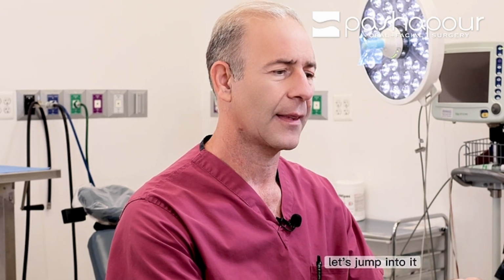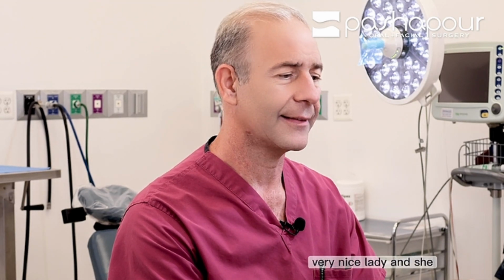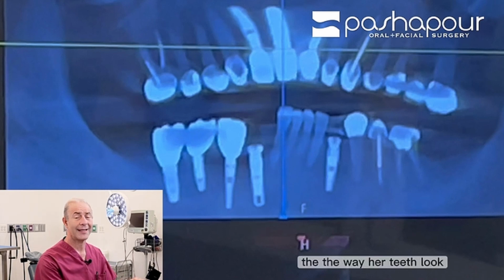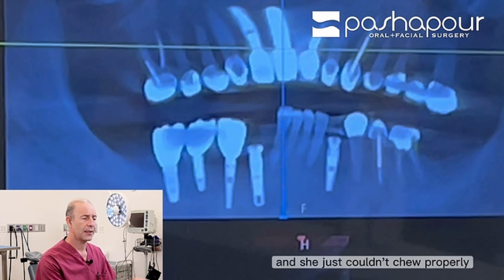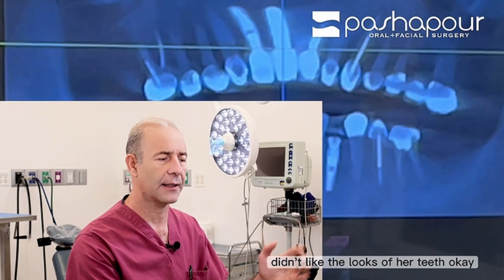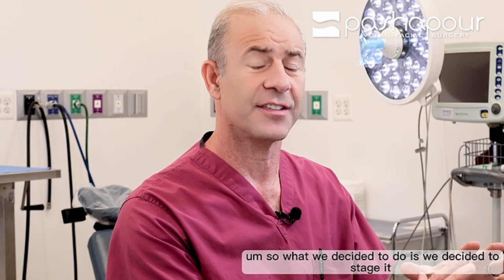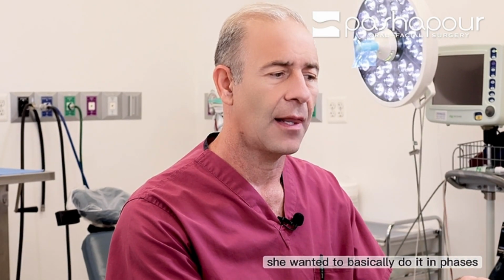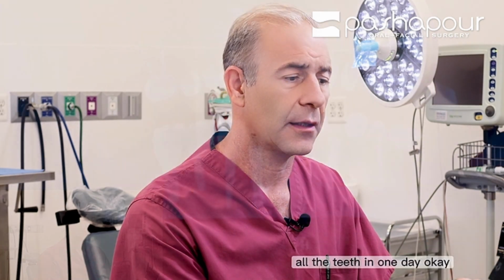Let's jump into it. This is a patient that came to me from New York City. Very nice lady, and she recently moved to the DC area. She said she doesn't like the way her teeth look. Her front teeth were flared out on the mandibular area, and she just couldn't chew properly and didn't like the looks of her teeth, okay? So what we decided to do is stage it, because she didn't want to do the whole arch at one time. She wanted to do it in phases, and she wanted to get crown and bridge done and not do a hybrid or all the teeth in one day, okay?